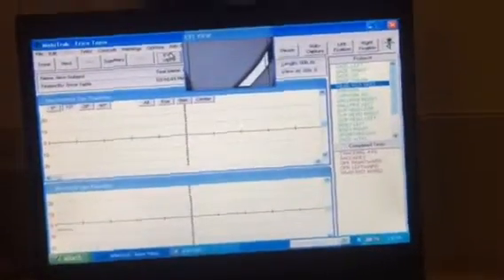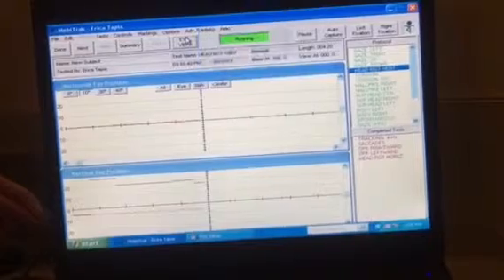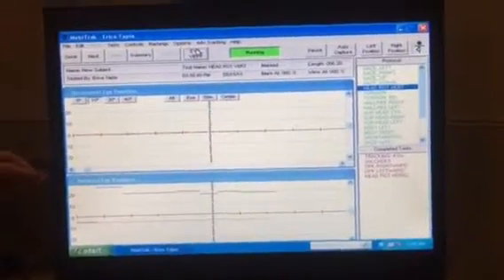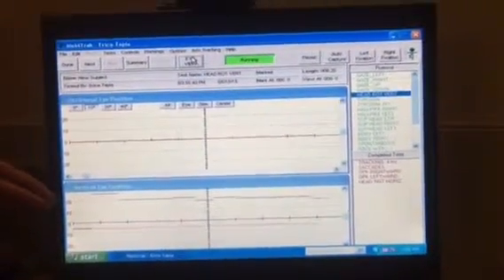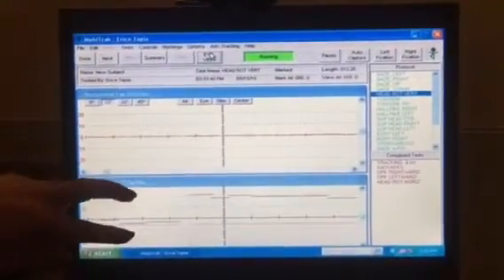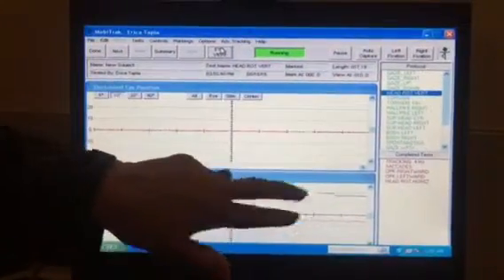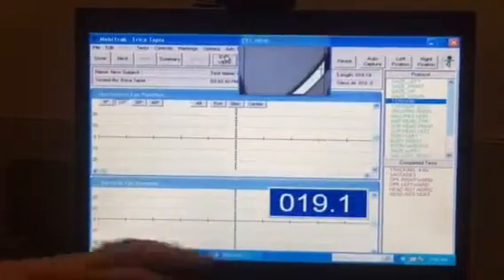Okay. Next test is head rotation vertical. They're saying yes, yes, yes, yes, yes. Up, down, up, down, up, down. And you put the fixation on. And then you want to see those two DNA strands. You've got to see the two DNA strands.